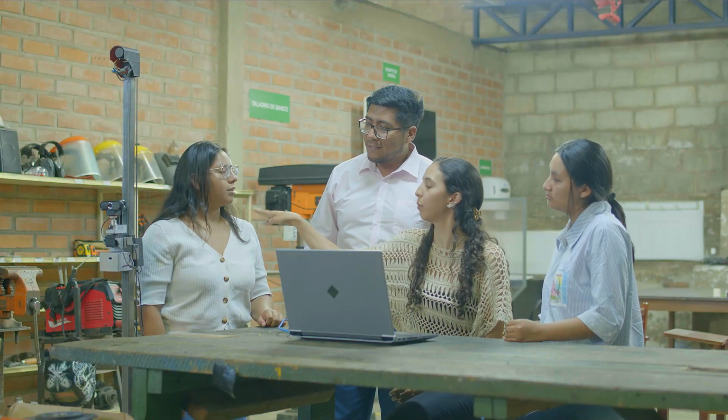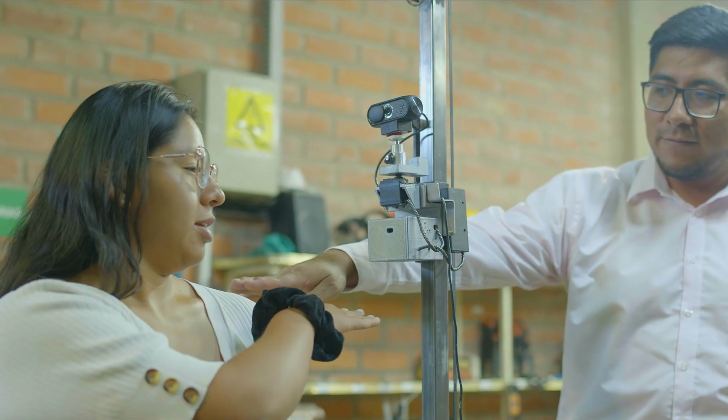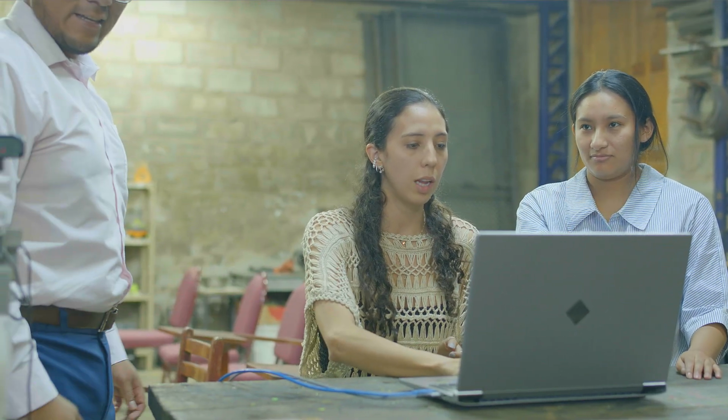BioTrack was created to solve this problem from an educational perspective. It is a system that standardizes the capture before measuring. The user enters their height and selects the joint to be evaluated. Based on the anthropometric proportions defined by Drillis and Contini, the system calculates a target camera height.